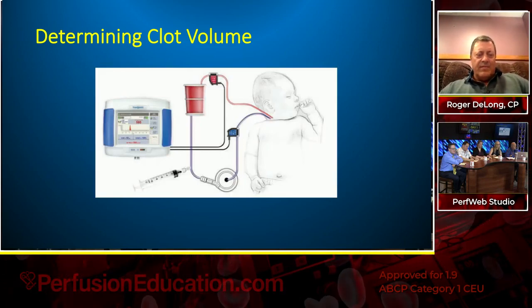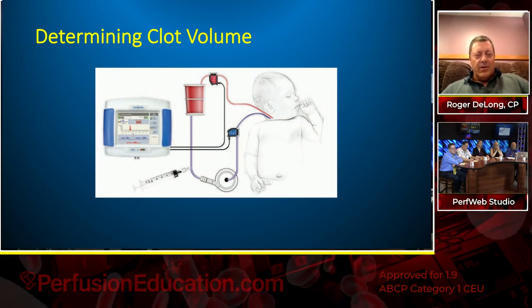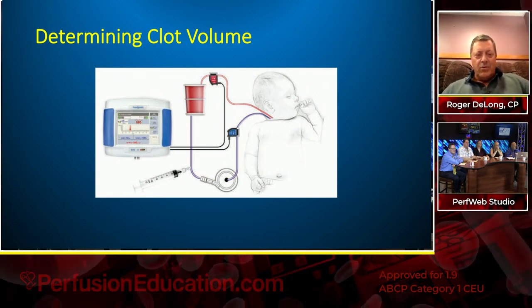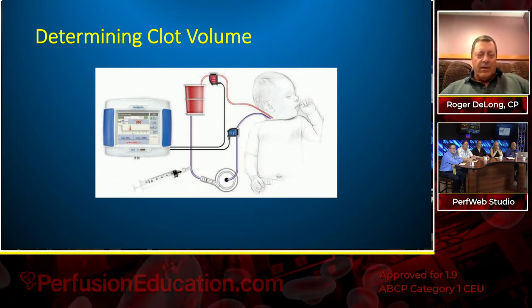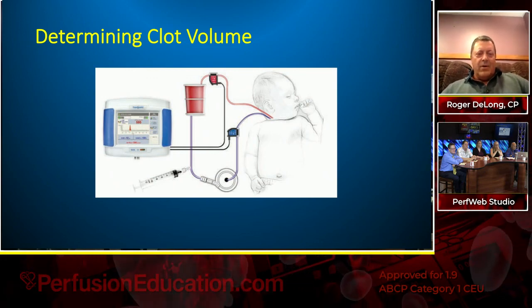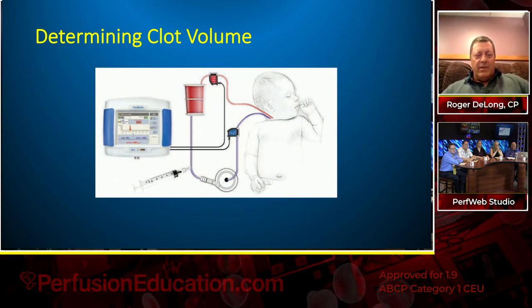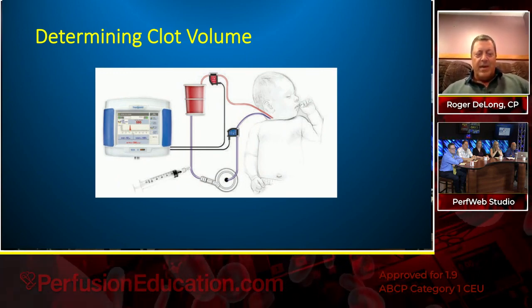It's a device that I was familiar with that has an arterial and venous sensor. Same flow sensors that are on the majority of heart-lung machines around the country. The difference with this is a regular sensor can measure instantaneous flow. This monitor totalizes. It'll take a time run and give you the amount of volume between time A and time B.